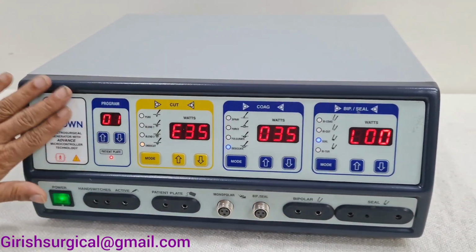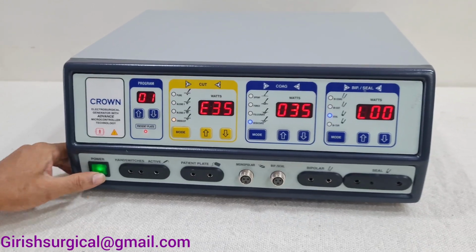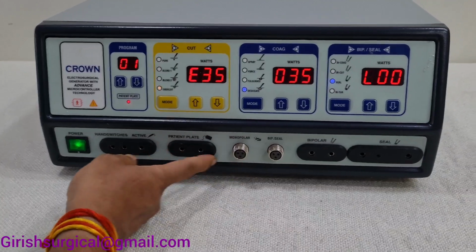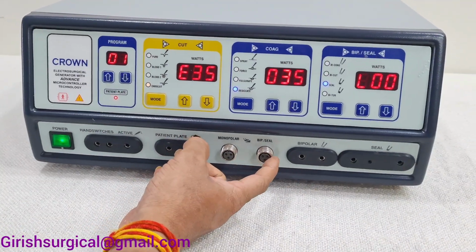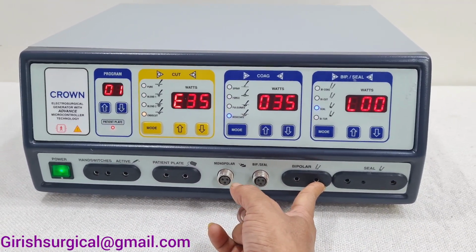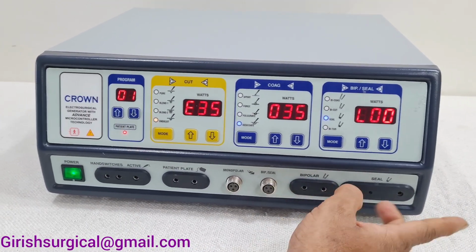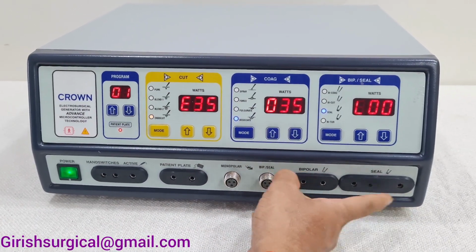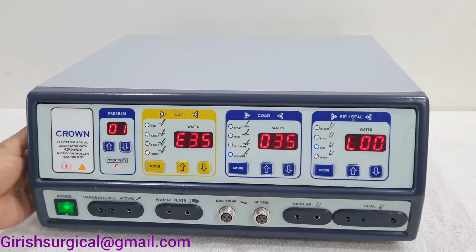So this is how the features of the front panel work. Now here on the left-hand side there is a power button. This port is for the hand switch and the active foot control. Here you connect the patient plate cable cord, monopolar foot switch, and bipolar seal foot switch. Here you can connect the bipolar, which you can use for underwater. This is the sealing mode for the bi-clamp. You can connect it, or the bicut scissor if you have an imported one, you can use it here. So all these features are there in this machine. This is completely all in one.